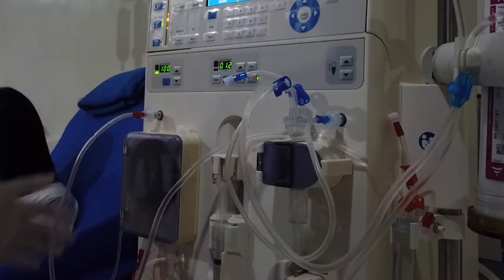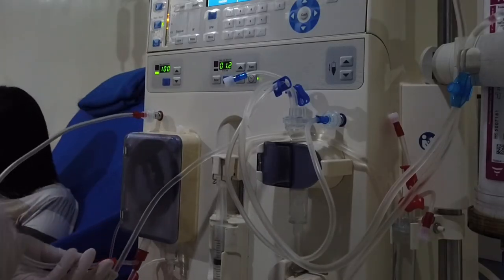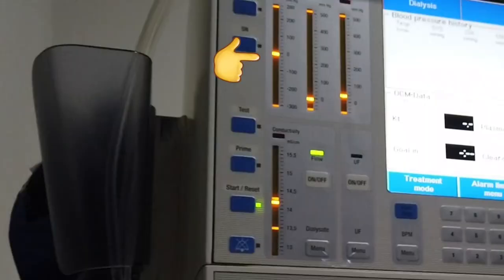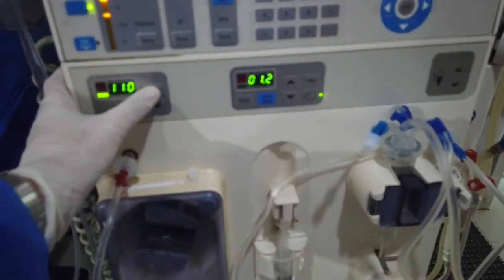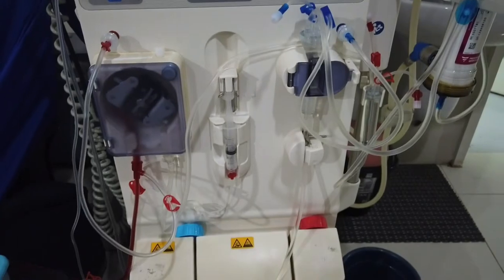Open the arterial transducer clamp to start arterial pressure monitoring. Observe for any high and low pressure and troubleshoot if needed. You can slowly increase the blood flow rate to a minimum of 150 ml per minute.